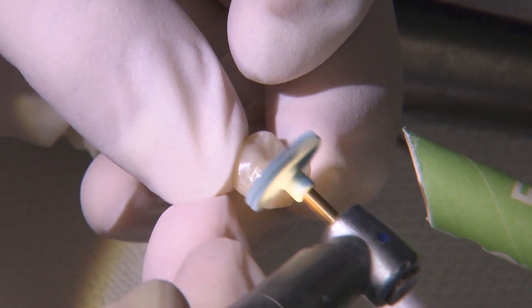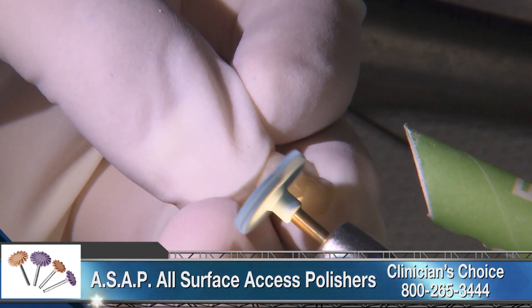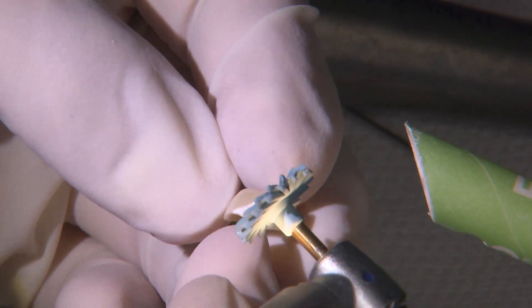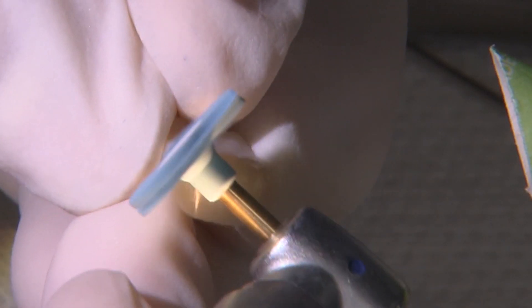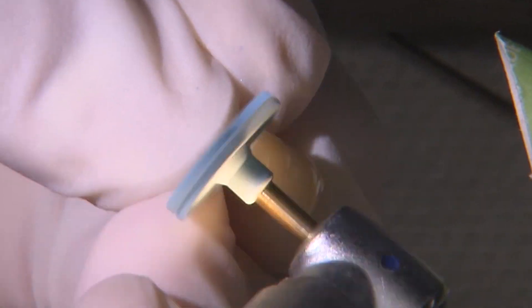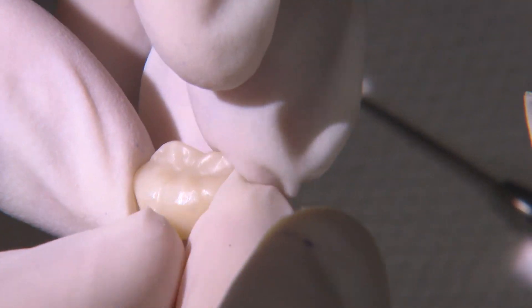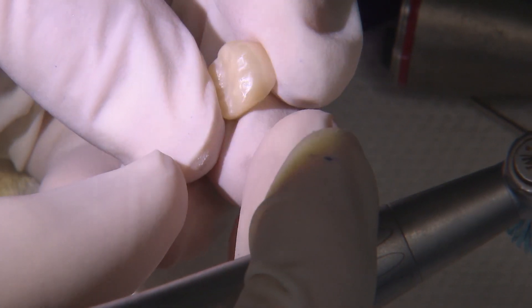I'll now complete the finishing of the crown with a spiral polisher from Clinician's Choice ASAP polishing kit. It's incredibly easy to get a high shine using these polishers on any type of restorative material. For our chairside milled Bruxer crown, I only use the pre-polisher since this patient's adjacent teeth aren't very smooth and shiny. Once I polish the restoration, the crown is ready for delivery.